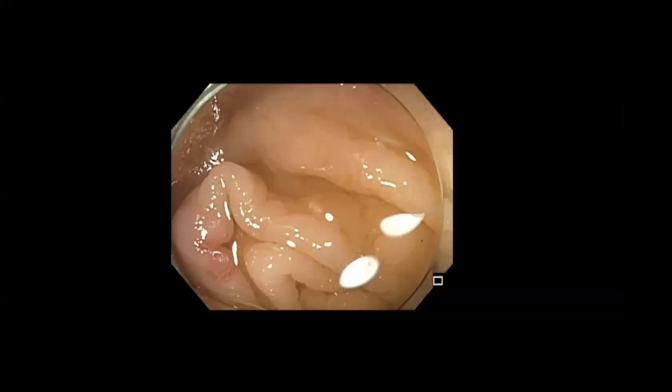It is almost C-shaped, and the top limb is relatively thin. The vertical limb of the C is much thicker, and the horizontal limb on the downside is again thinner. So there is something beneath that red lesion that we see.